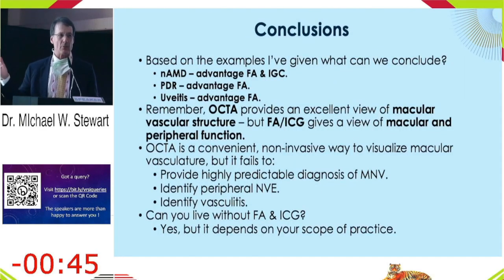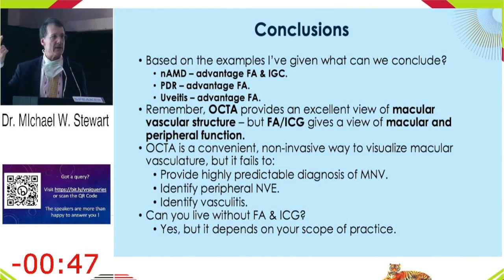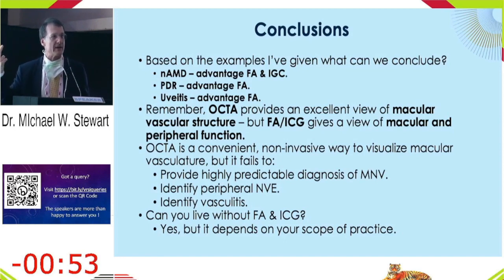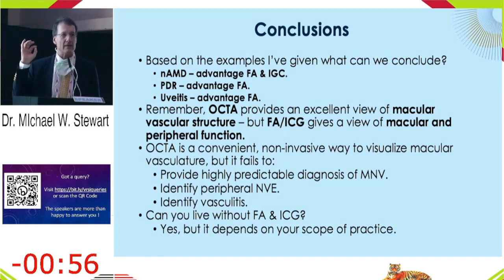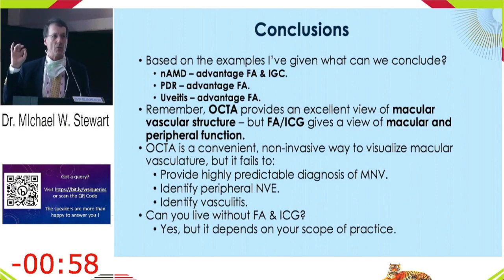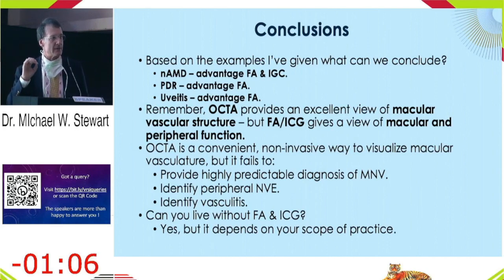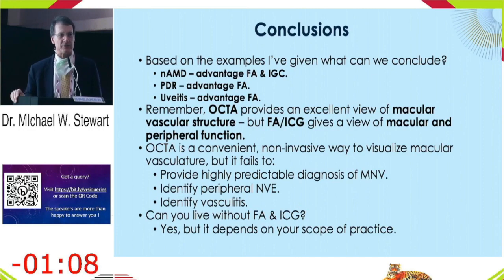So in summary, for neovascular AMD, diabetic retinopathy, particularly proliferative retinopathy, as well as posterior uveitis, I think you can see that the addition of fluorescein and ICG angiography, in addition to OCT, gives you your best information and actually your best ability to both diagnose and manage patients to the best of our ability.